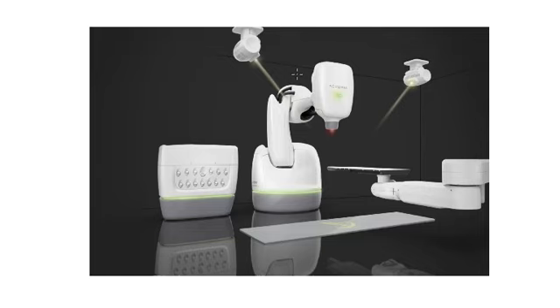Here's the exchange table of different collimator sizes that a robot can pick up. The patient sits here on the couch, and then it has an imaging system. There are two X-ray tubes up in the ceiling here and here, and a beam comes down from the tube and is imaged by panels in the floor. And so you get two images, one here and one on the other side.